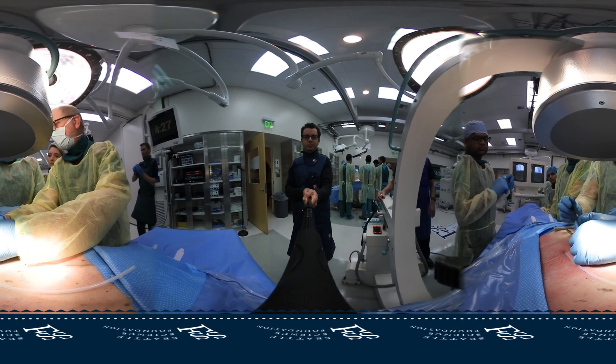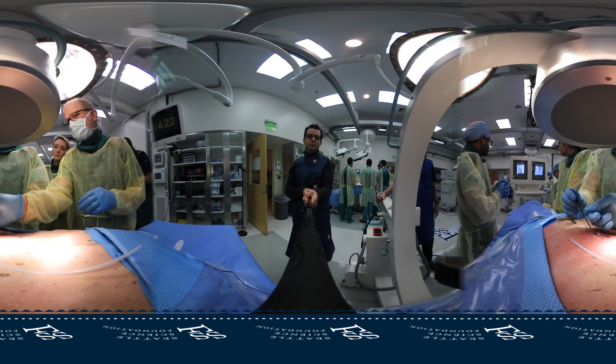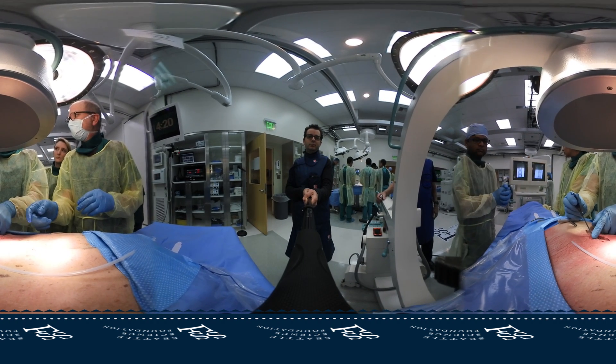You need to come back and be steeper — you really want to touch down. Be really steep and touch. Now do you feel? Is that bone?